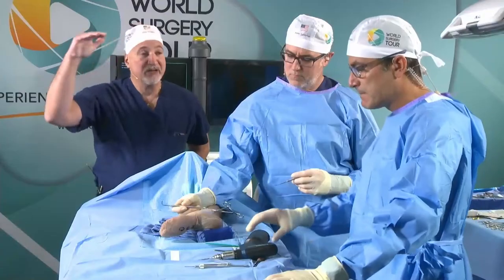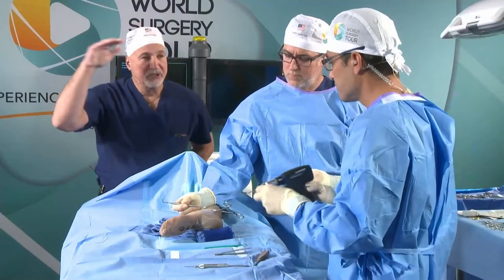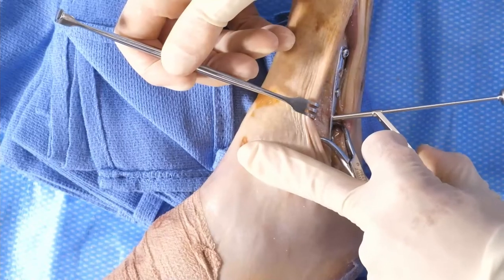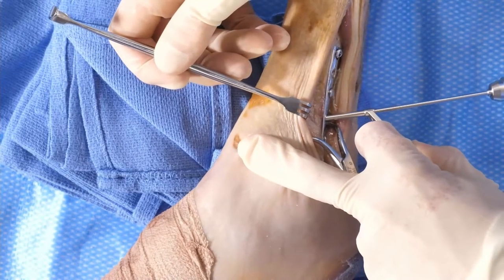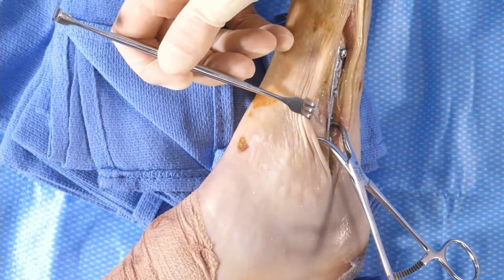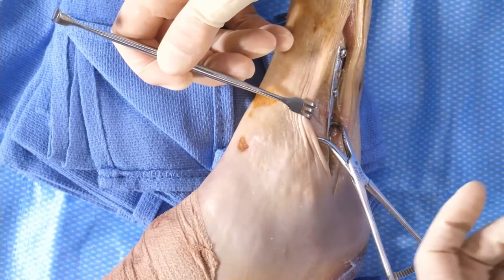From high to low. We were talking about concepts a couple of minutes ago, principles. I'm going to go right back down to sort of nuts and bolts. Hobie, how are you bending this plate? What instruments are you going to use to bend this plate? And is it just your basic knowledge of the anatomy, or are you trying to use a template when you're bending a plate?